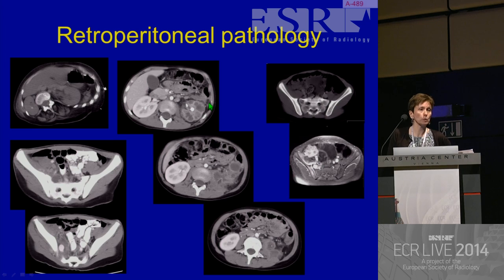The child had abnormal bloods and raised inflammatory markers. And this child also, when questioning the parents, had a vague history of back pain going back 6 weeks. So unfortunately, because of the history of trauma, he got CT in the local hospital. If we'd known about it, ultrasound would have been our choice of investigation. But he does have xanthogranulomatous pyelonephritis with a big associated psoas abscess and calculi extruded from the kidney into that abscess, and also more pararenal inflammatory change and abscess.